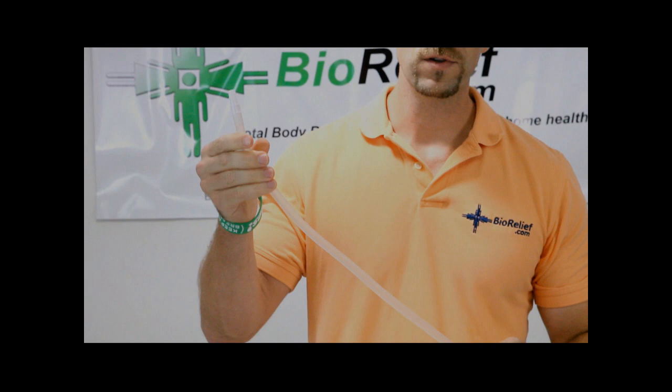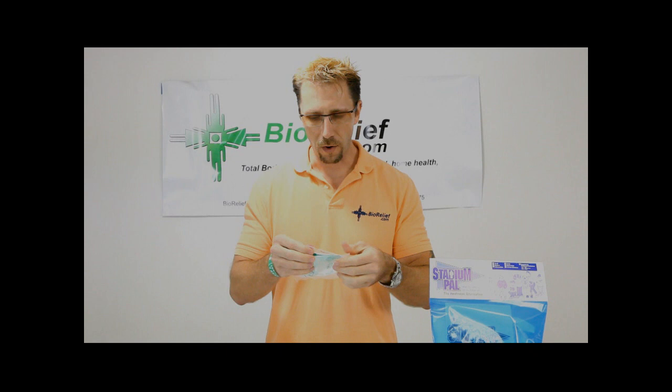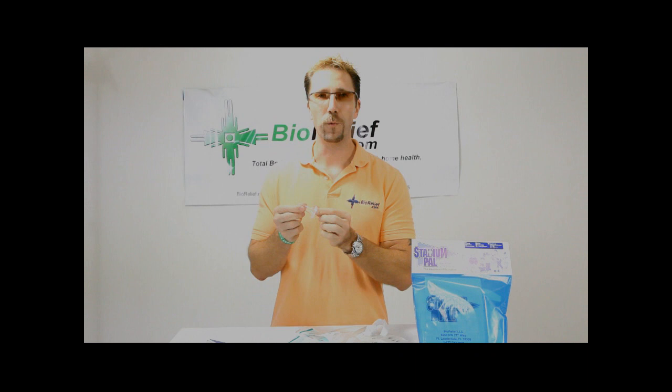This travels to a male external catheter. A male external catheter is simply what they call a condom. This particular one is latex-free and it's made of 100% silicone.